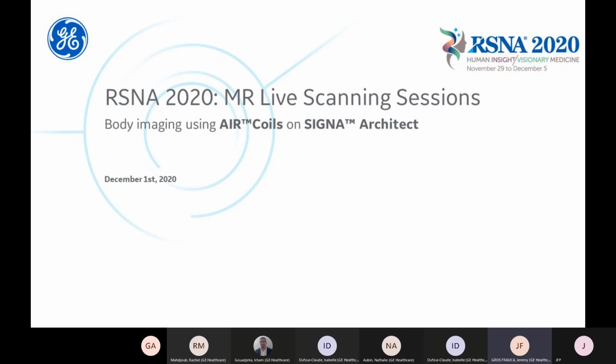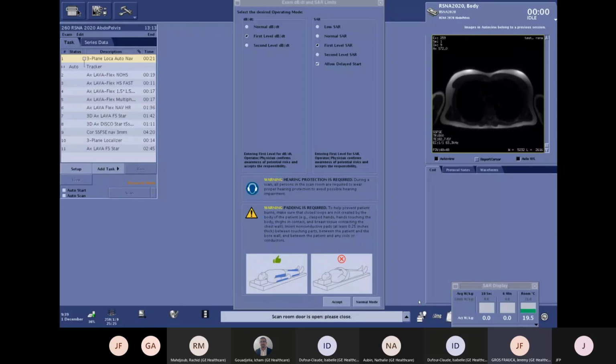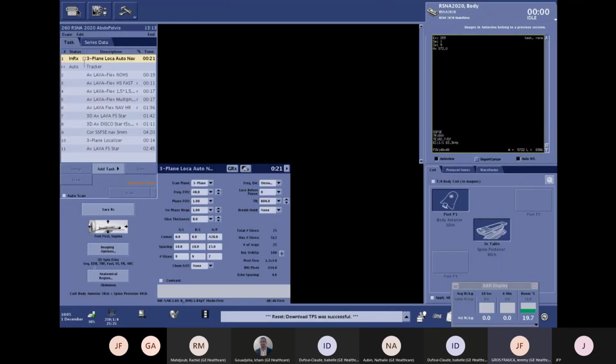It's also interesting to use this coil if you want to acquire TAP, if you want to have a very big coverage. With only one coil, you have a big coverage, as you can see on this tall volunteer. And if you combine two anterior array coils, you can do a whole body examination. Let's hand over to Jérémy to continue the presentation.